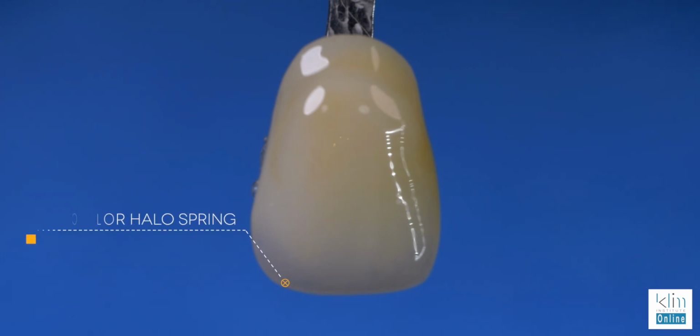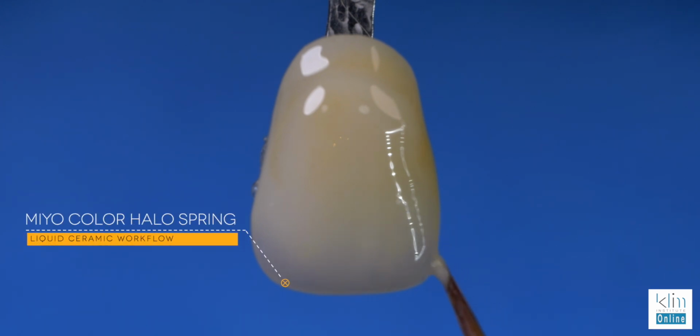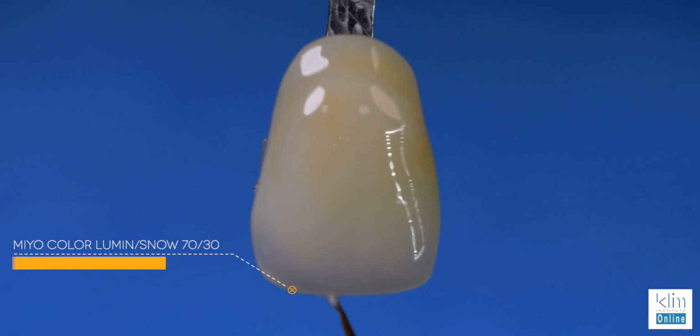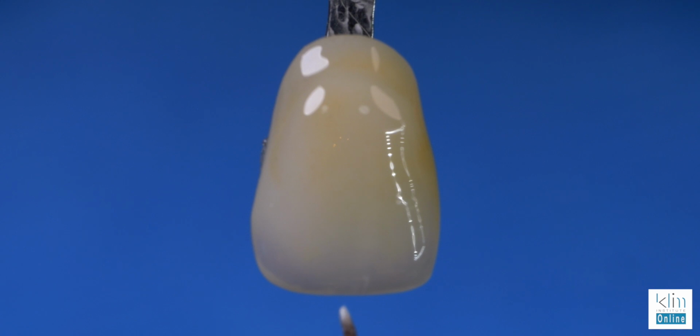Here, this is Halo Spring to enhance the incisal halo. And you can see how it just really makes that contrast between the low value and high value. Then we'll come with a combo of Lumen and Snow, that's 70 to 30%. So keep the Snow really low, 30% of the Snow. And here we'll create enamel effects, building that over the low value of the Storm and the smoke.